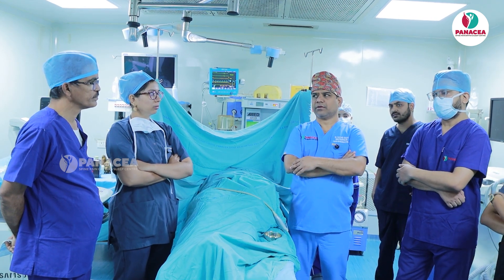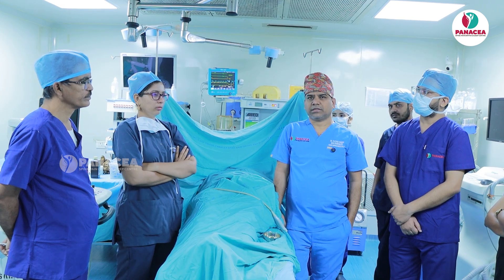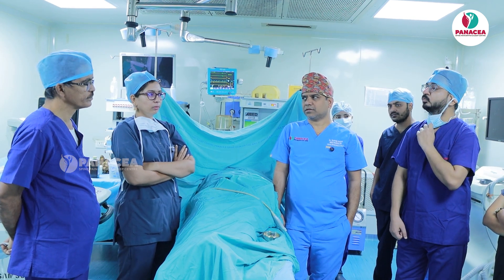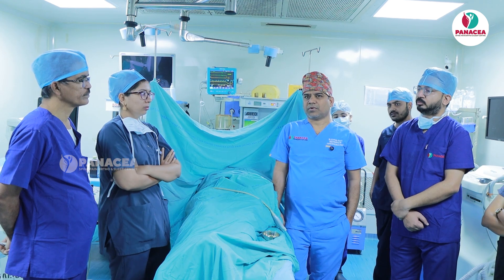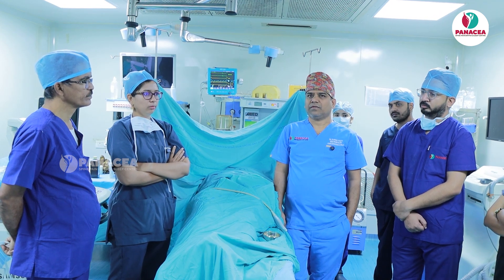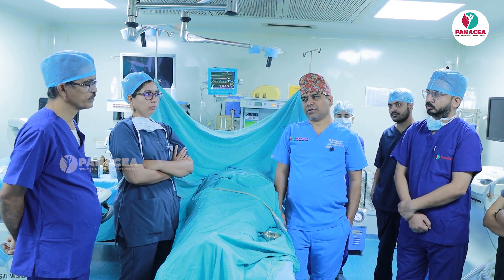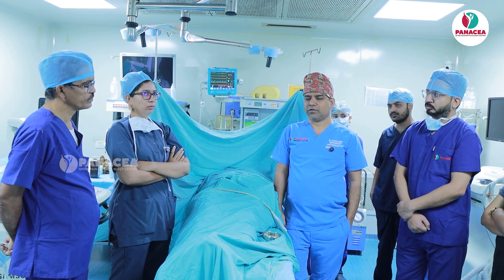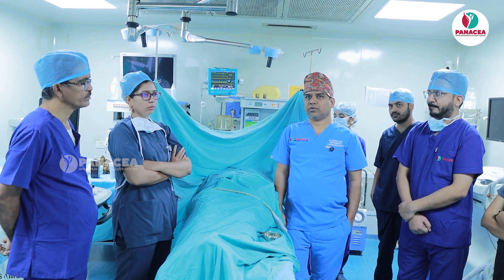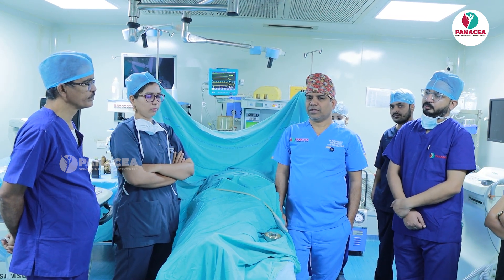We usually do a diagnostic block under ultrasound guidance. Initially we can give some amount of depo-medrol along with local anesthetic. If the patient wants longer lasting relief, we do pulsed RF. There are certain landmarks where under ultrasound guidance we can locate the LFCN — approximately 10 centimeters, or four finger-widths, below the anterior superior iliac spine — where there is a tunnel between the tensor fascia latae and sartorius, with the rectus femoris posteriorly. In that fat-filled tunnel you can find the LFCN.